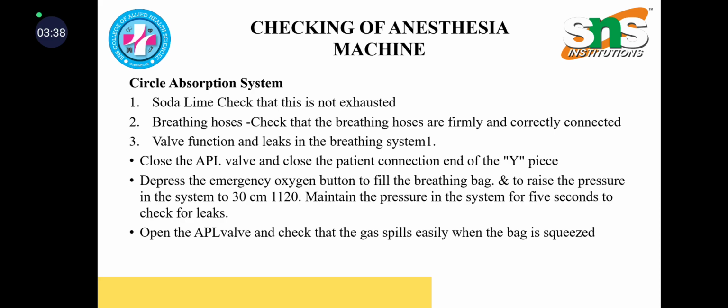Breathing hoses. Check that the breathing hoses are firmly and correctly connected. Valve function and leaks in the breathing system. Close the APL valve and close the patient connection end of the Y-piece. Depress the emergency oxygen button to fill the breathing bag and to raise the pressure in the system to 30 centimeter H2O. Maintain the pressure in the system for 5 seconds to check for leaks.